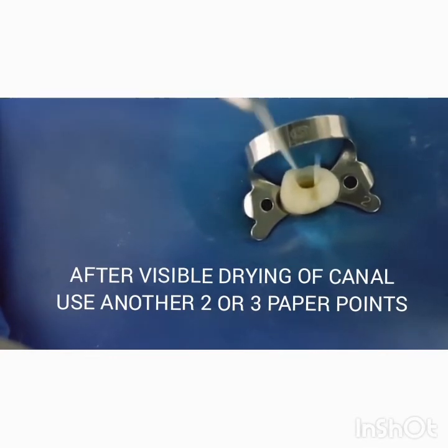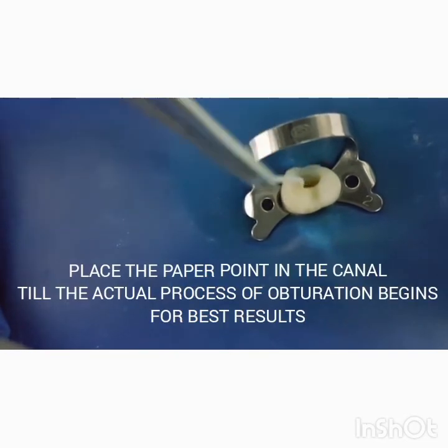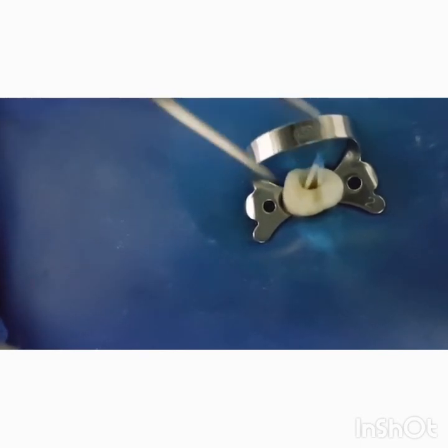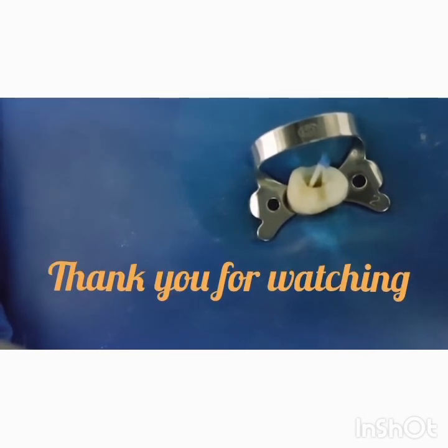Use 2 to 3 paper points per root canal. After you feel that the apical third of the canal is also dry, I would recommend placing the paper point inside the canal until you actually begin the process of obturation. Remove the paper point right before obturating the root canal.